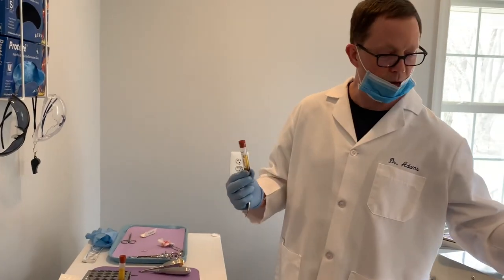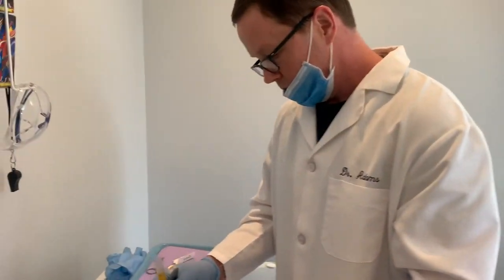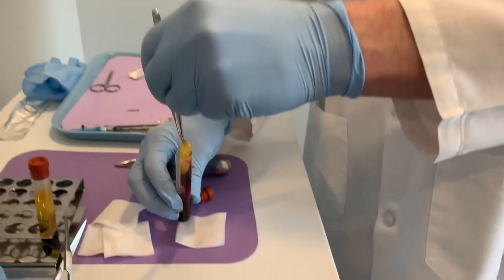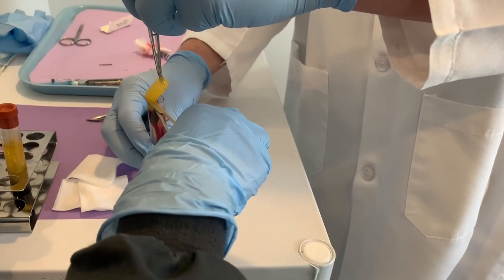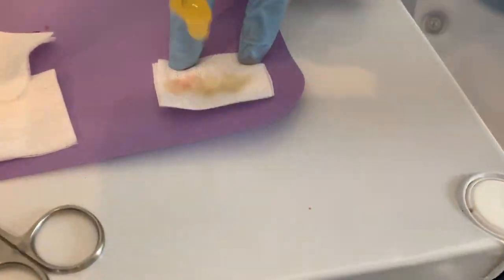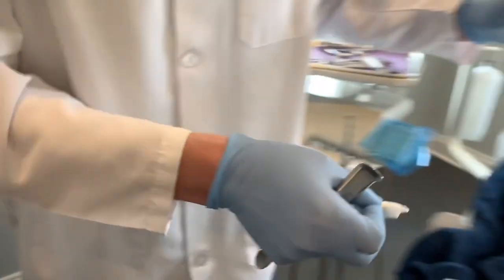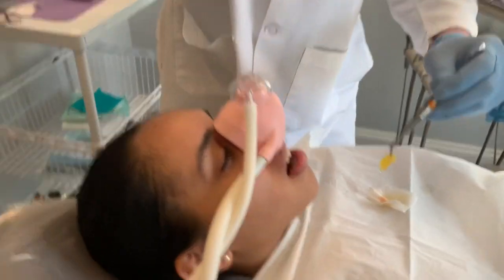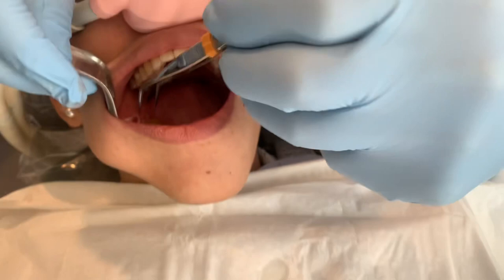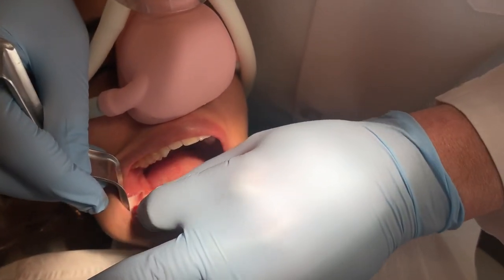And yeah, I think we're going to go ahead and tap into one of these. Up there and close, and we want to get the red part of it off. This stuff is very fluid, and we want that fluid. I'm going to come over here to our extraction site. We're going to put the platelet-rich fibrin in here. It looks very substantial.